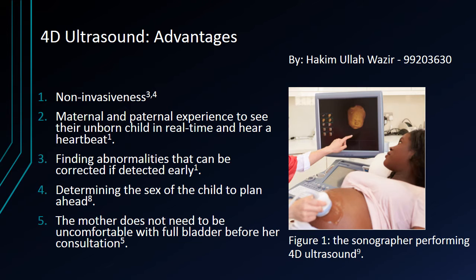The ultrasound would be able to show the health status of the placenta and the baby's body development, i.e., the spine, lips, fingers, toes, and the brain. The sonographer will be able to take note of the amount of amniotic fluid and will reassure the mother that everything is okay.